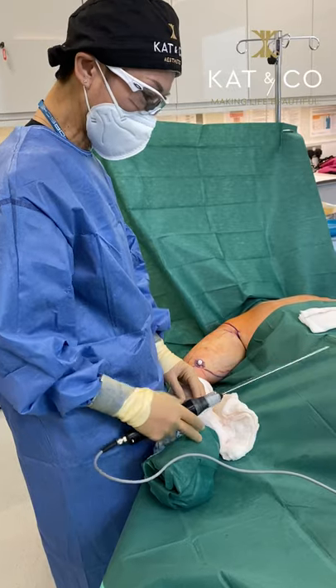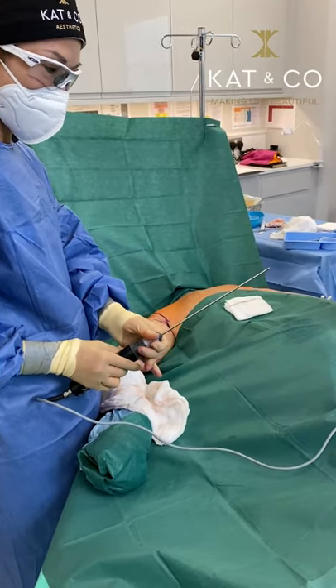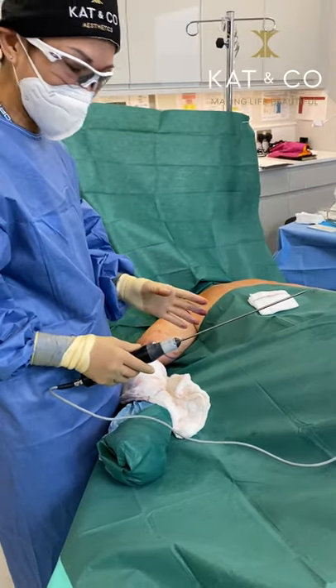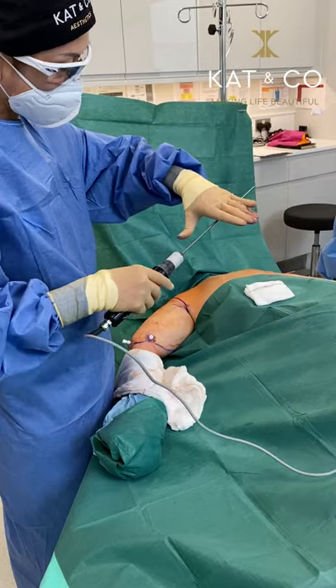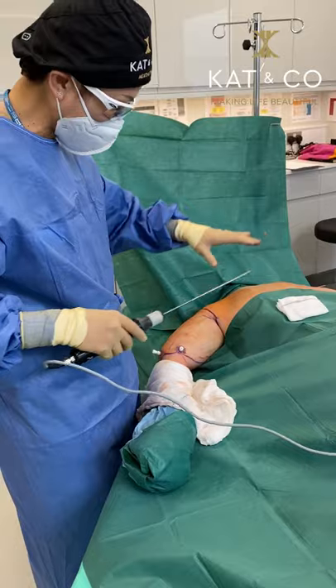So I'm putting in the vaser liposuction now. This is the high energy ultrasound probe that will melt the fat — but not just that. The probe goes underneath the skin and it's helping to tighten the skin at the same time.